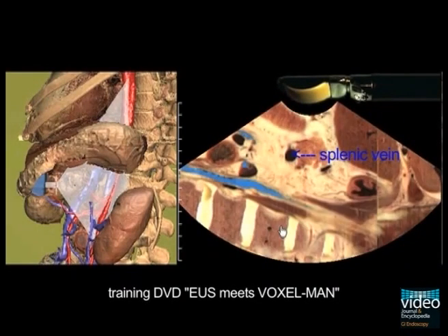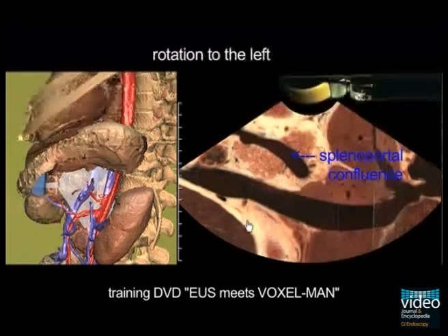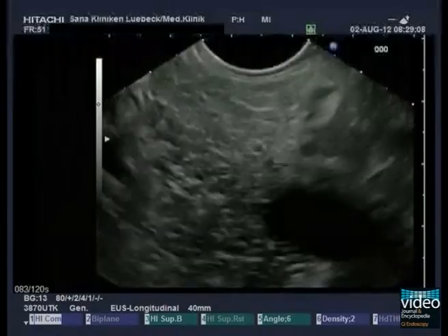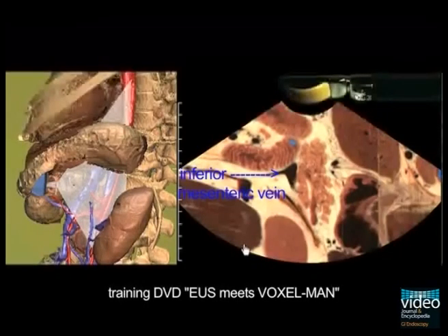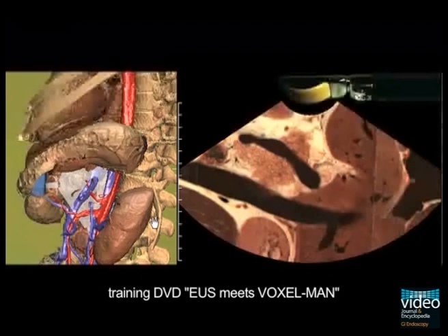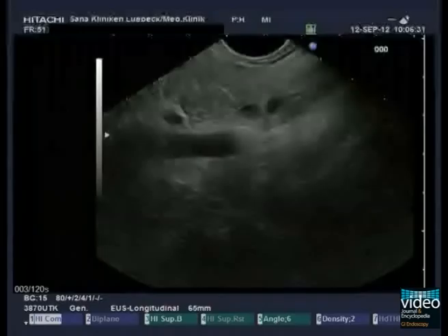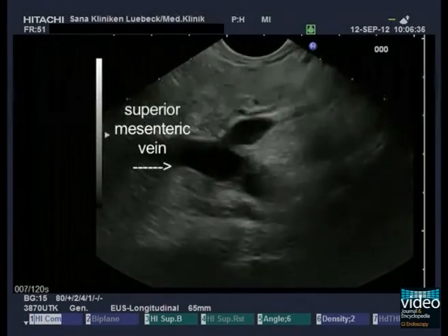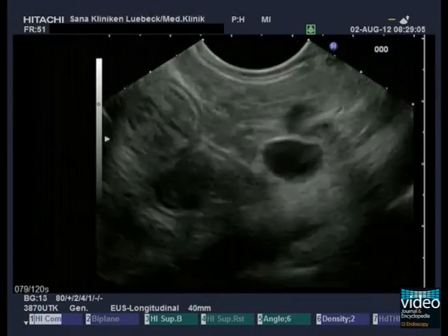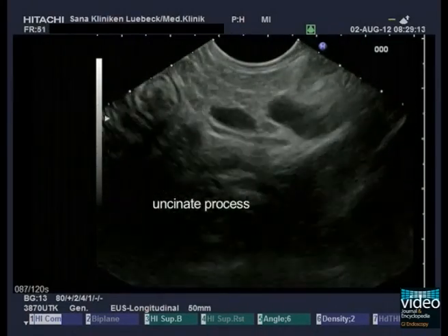Once you have identified the splenic vein, it is easy to follow the vein into the splenoportal confluence by a careful rotation to the left. On this way, sometimes the inferior mesenteric vein is visible. The superior mesenteric vein reaches the confluence caudally in front of the inferior cava vein. In addition, parts of the pancreatic head and of the uncinate process are observable in front of, respectively behind, the confluence.